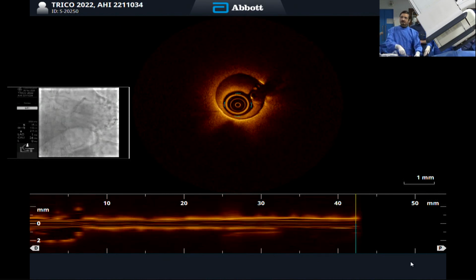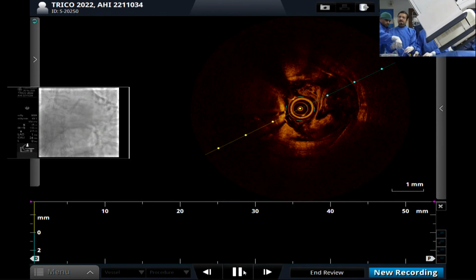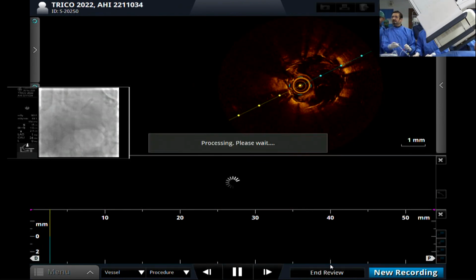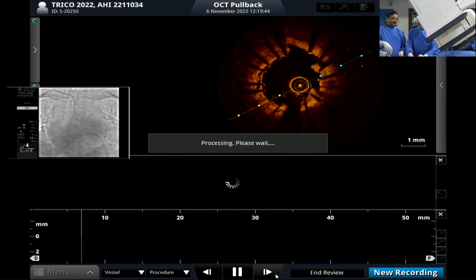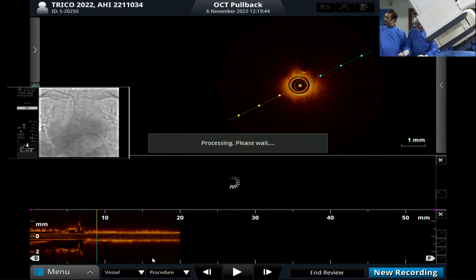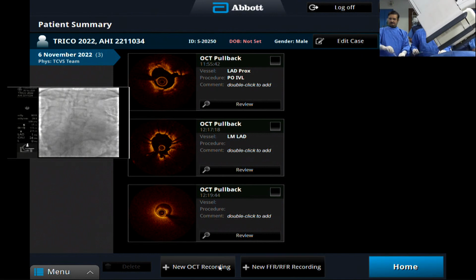Syringe drop. No problem. Where is the wire? It came out. Everything is okay, no problem. Do you see anything? Syringe drop. It's okay. Now let me take the final views then.